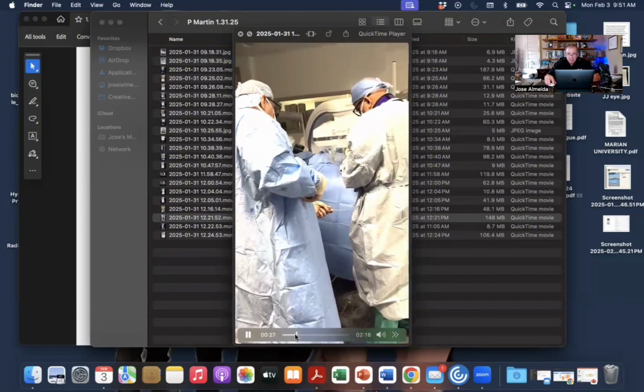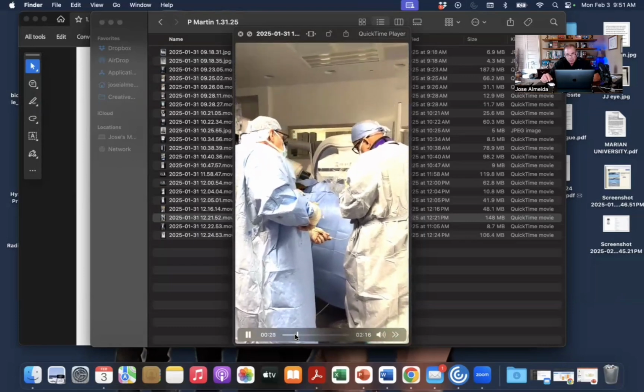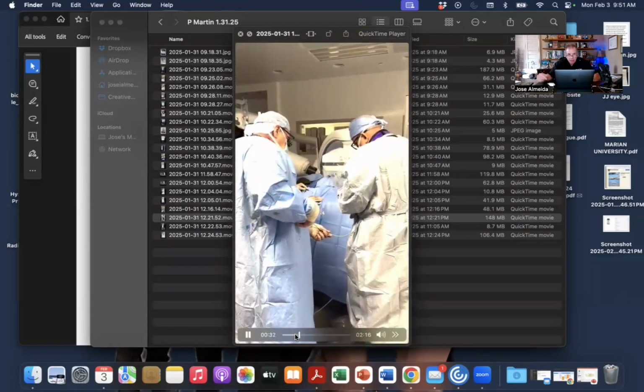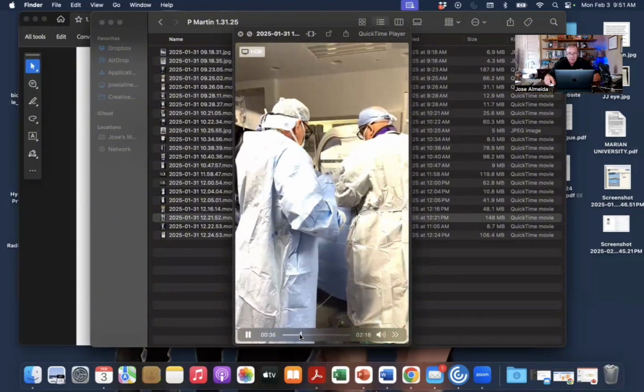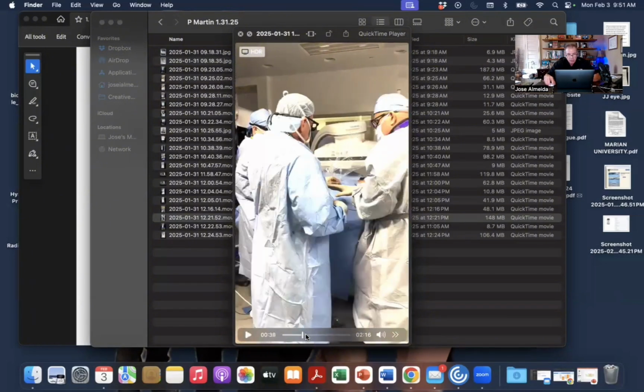That was the idea. And then from below, where we access from the tibial vein, kind of connect a tract from above and below, working above and below, and recanalize that occluded common femoral vein. So that's what we're trying to do here.